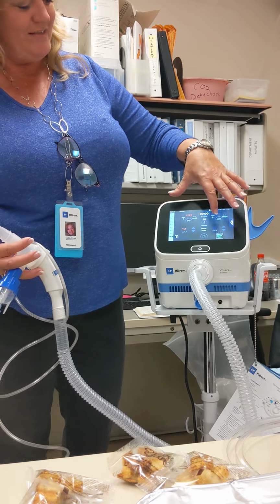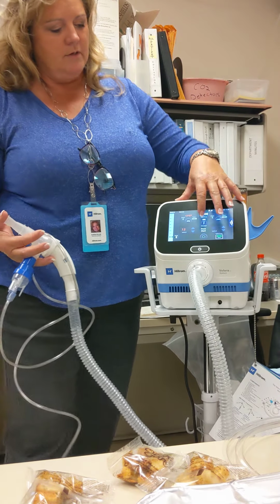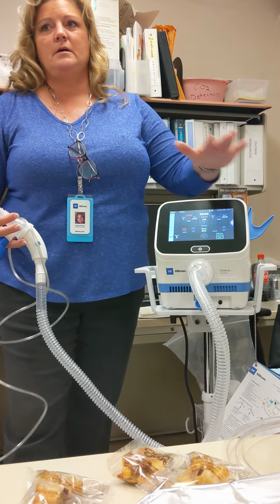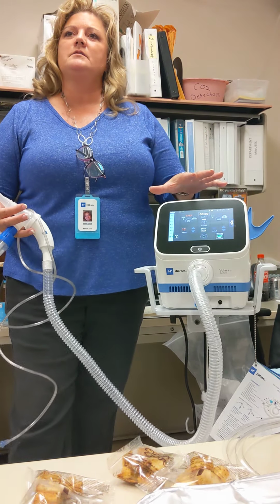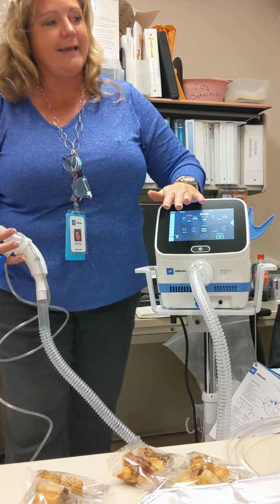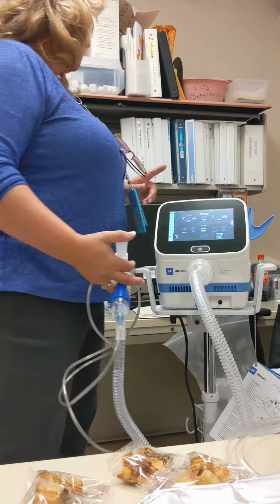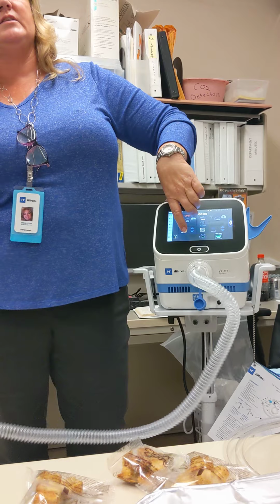When you hit the manual, you'll see that it automatically chooses your nebulizer. So we know we're going to turn that off. Now, your lung expansion, oscillation, right? We were taught to go 2.5 minutes, 2.5 minutes. But this is what's great about this device. We put it in you, you guys are the drivers, because maybe some patients don't like the 2.5 minutes of lung expansion. Maybe they can't tolerate it. So we'll start on lung expansion, and usually for an adult, this starts at 5, it goes up from as low as 5.